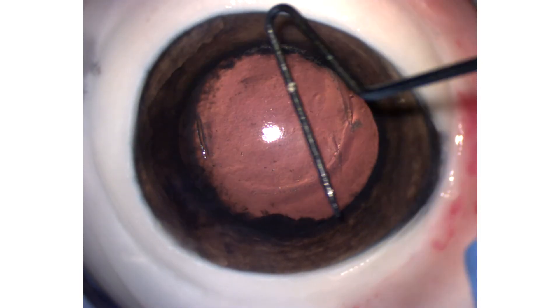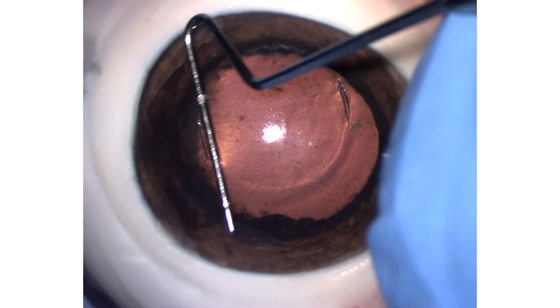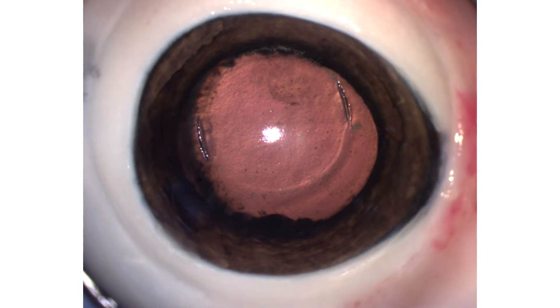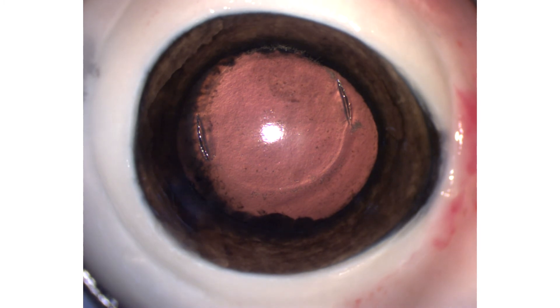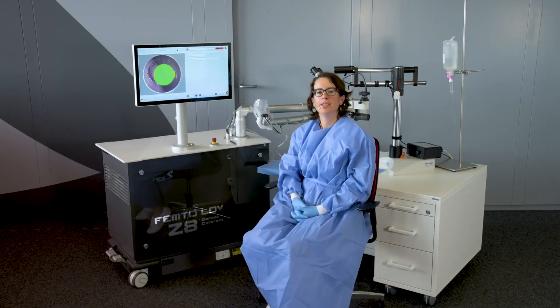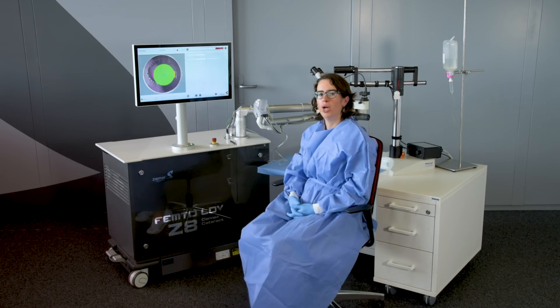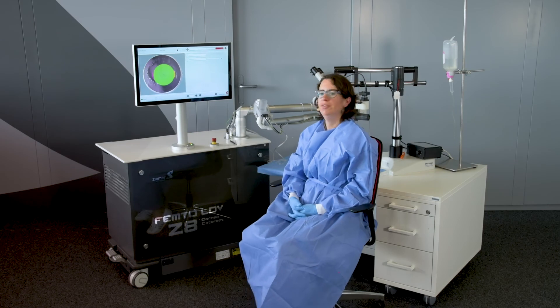And have a look to the stroma after the lenticle extraction. So here everything is fine. So that's the vet lab is finished then. I thank you for your attention, and thank you again also for your interest in our application and in our Femto LDVZ8.